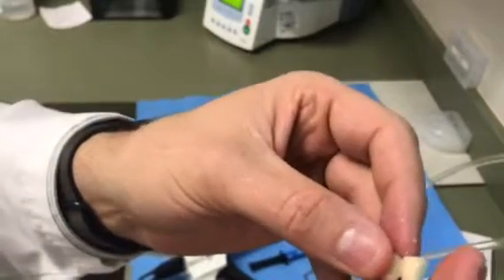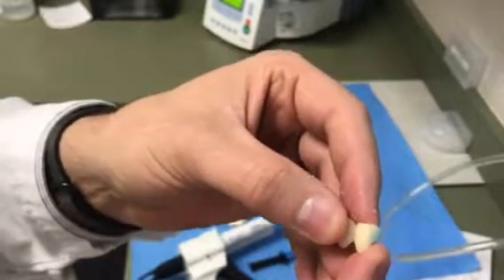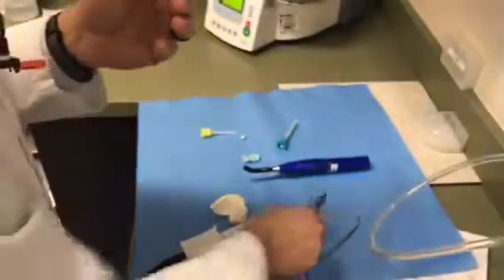So this works well for contacts. Especially works well when you're trying to make adjustments in your gingival embrasures, close those gingival embrasures, which I'm kind of very particular about the shape of my gingival embrasures. So I do that all of the time.